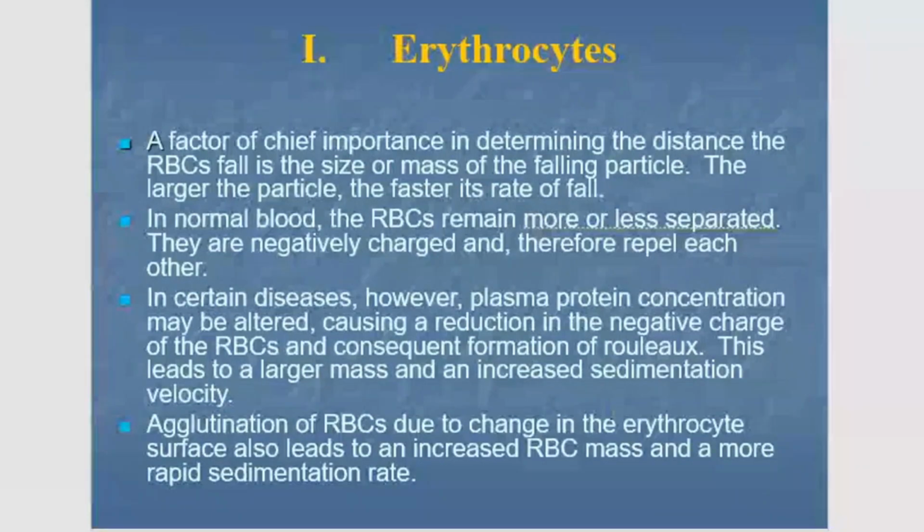Okay, so what are erythrocytes? We already know that erythrocytes are the factors of chief importance in determining the rate at which RBCs fall, which depends on the size or mass of the falling particles. The larger the particle, the faster its rate is.